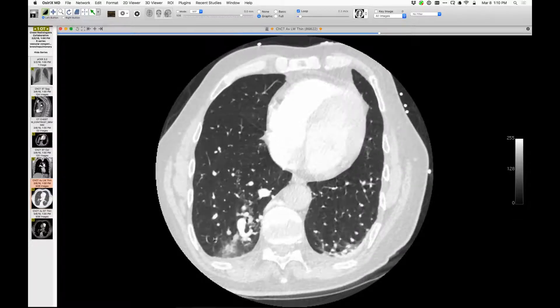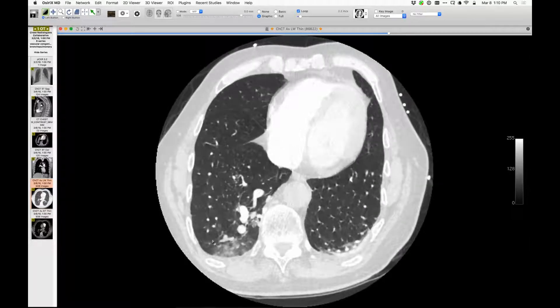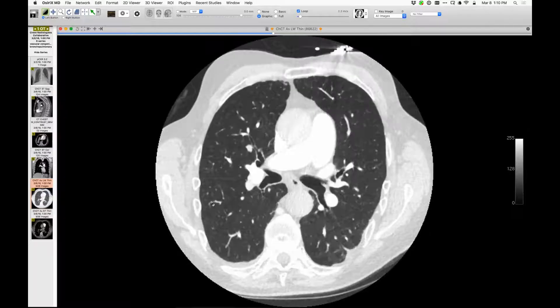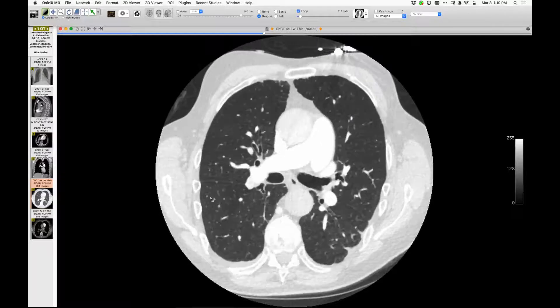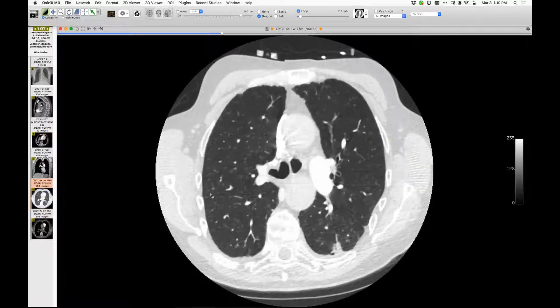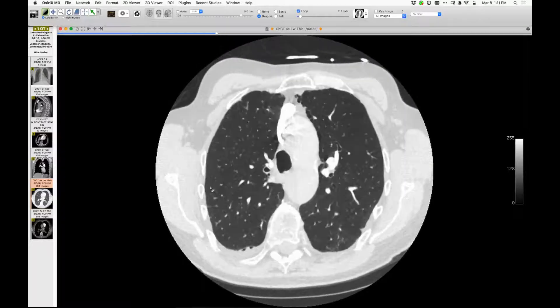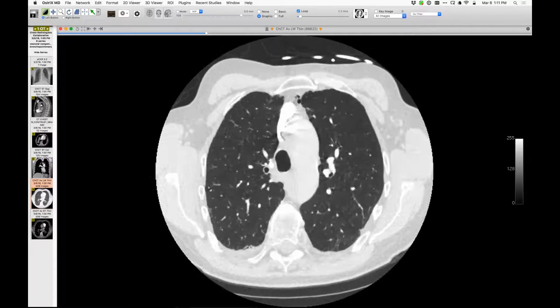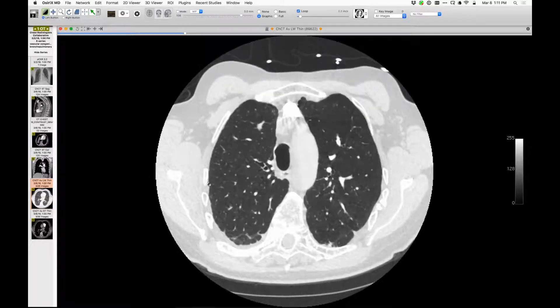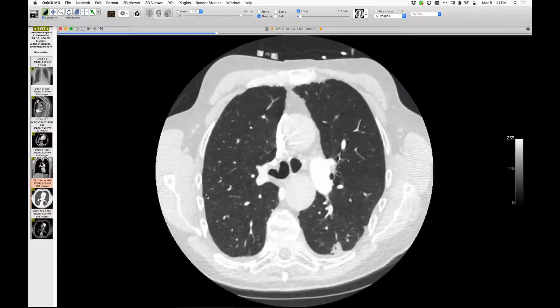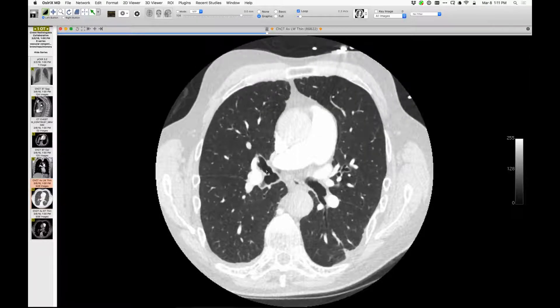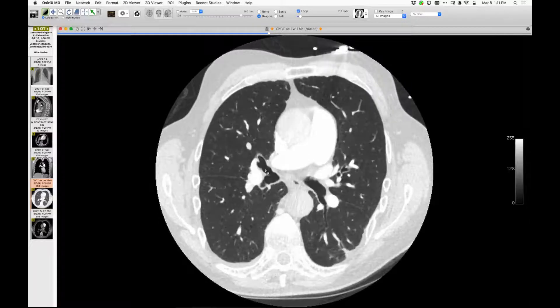It looks like there's no horizontal fissure in that case. The upper lobe is very odd looking — there's a funny bronchus there to the upper lobe, and it's missing an anterior and posterior segment, and there's no horizontal or minor fissure. So it kind of looks like a hybrid middle-upper lobe, almost like a lingula. And this middle lobe bronchus is relatively big. Looking at the axials, I can't pick up what looks like a minor fissure, so there may be a combination of the right upper and the right middle lobes together, with some unusual branching — there has to be an airway abnormality.